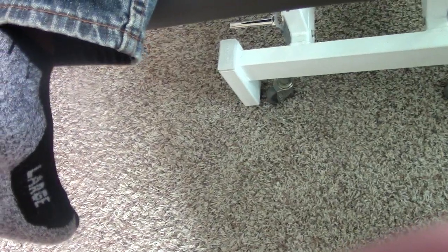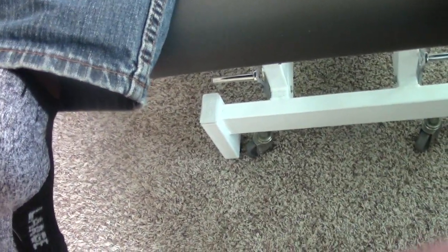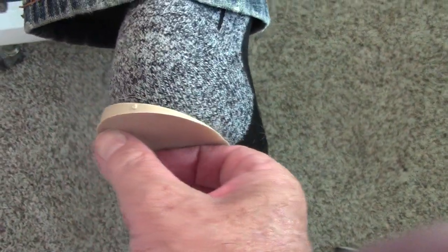This is when a heel wedge is very helpful. So we put a heel wedge in his shoe with the high part of it medial.